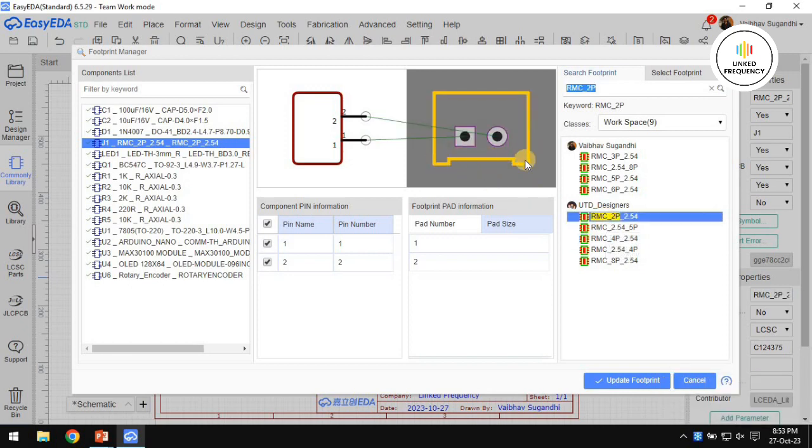You can look at this. This notch will indicate one side of the entire connector. So by mistake also, there is no possibility that a person can insert it the other way.